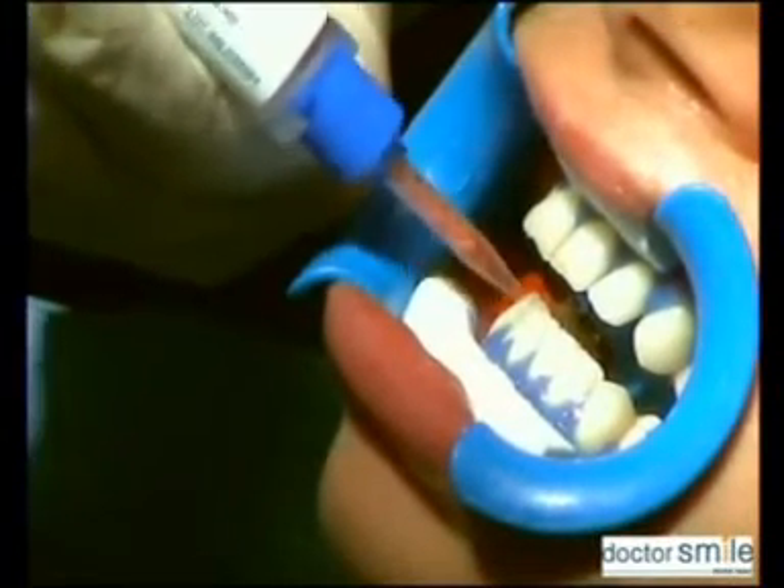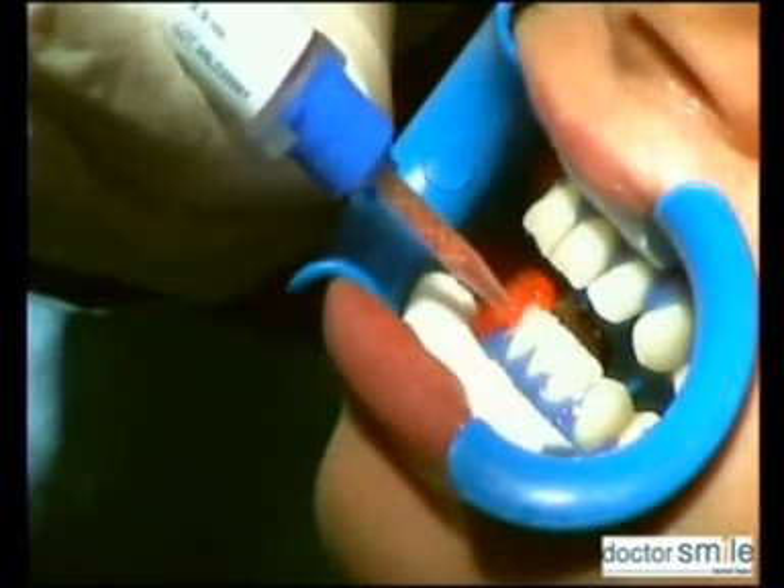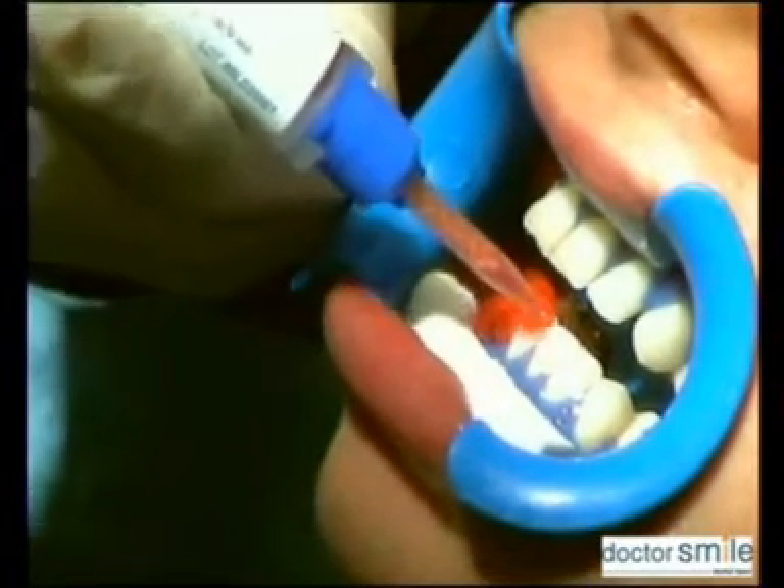Apply whitening gel, filled in a bi-component syringe, over all the frontal surfaces of the teeth with two millimeter thickness.